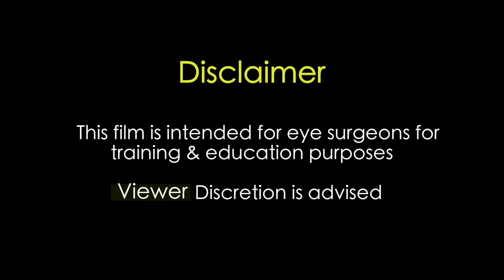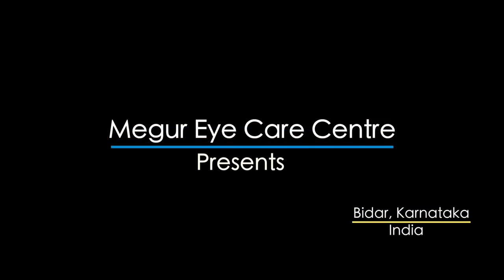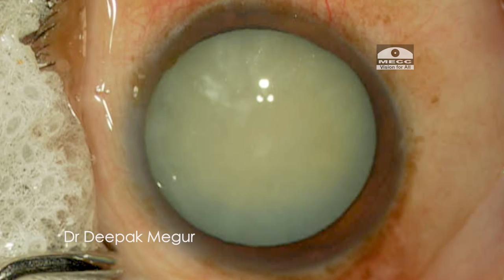This film is intended for eye surgeons for training and education purposes. Viewer discretion is strongly recommended. Hello friends, today I'll be sharing an unusual complication during cataract surgery.